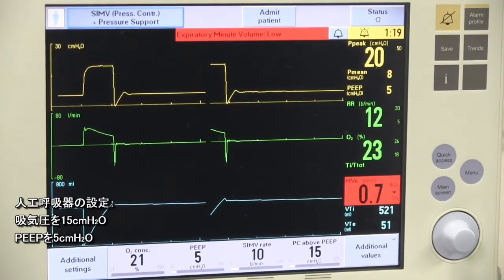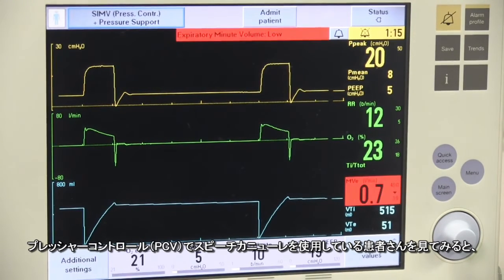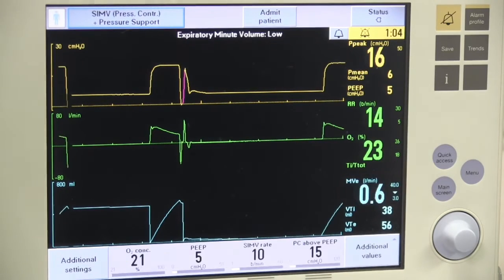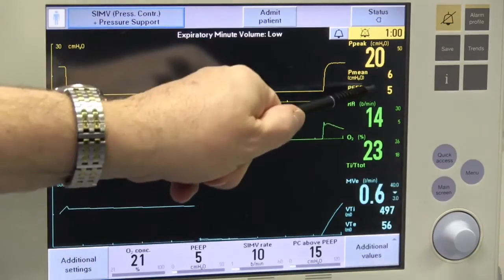Now let's look at a patient in pressure control with pressure set at 15 centimeters of water, pressure support at 10, and PEEP of 5. Because pressure is the controlled variable in this mode, peak inspiratory pressure will not exceed the pressure at which it is set. And again, you can see that PEEP is maintained.